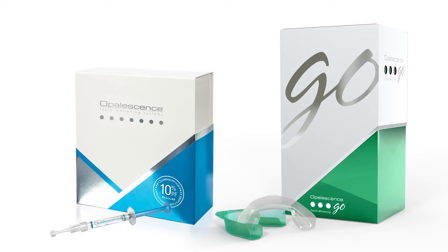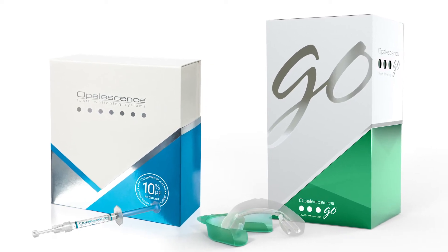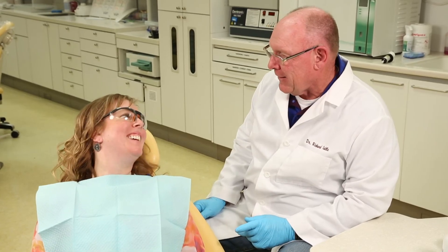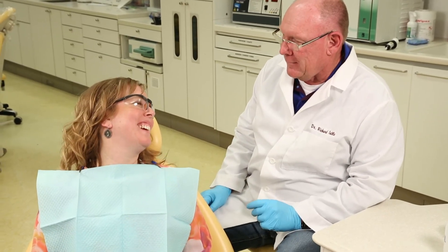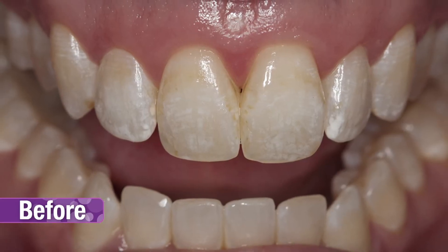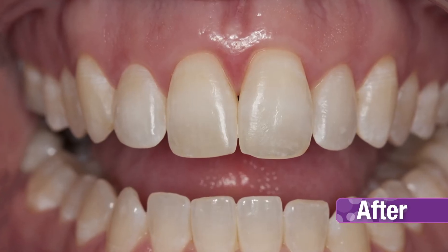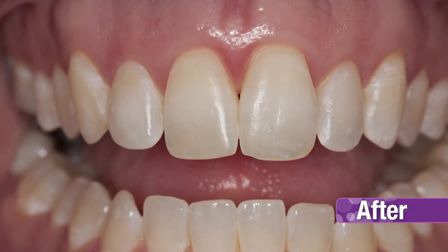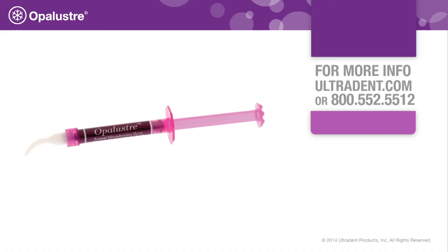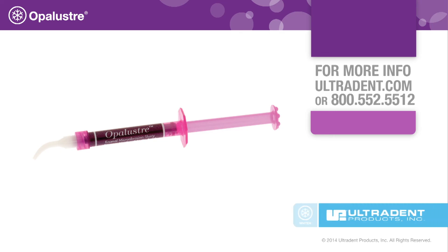Take-home whitening products can be used pre or post-op to blend and further whiten treated teeth. If the patient is experiencing any sensitivity, wait 24 hours before using take-home whitening products. Take post-op photographs to record the outcome. In this case, a single office visit resulted in significant improvements to the enamel. Contact your Ultradent representative for more information on Opal Luster and our entire menu of whitening treatments.